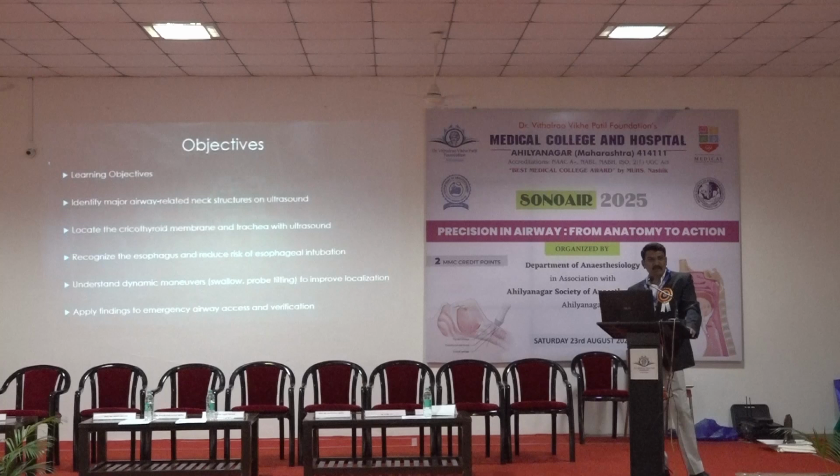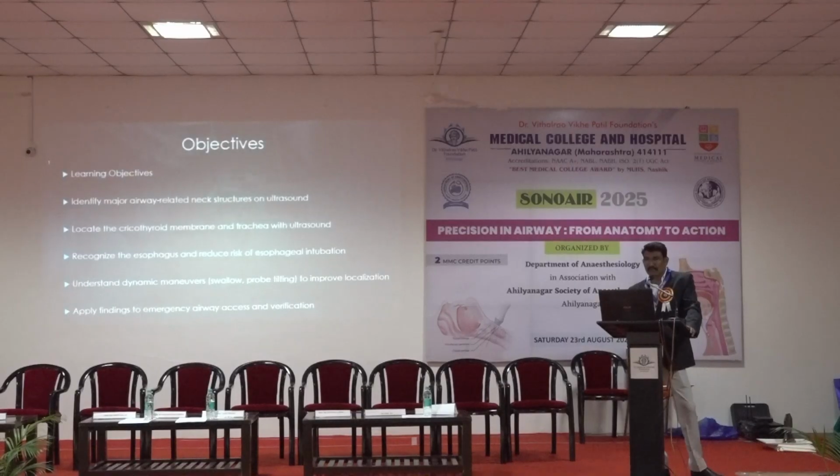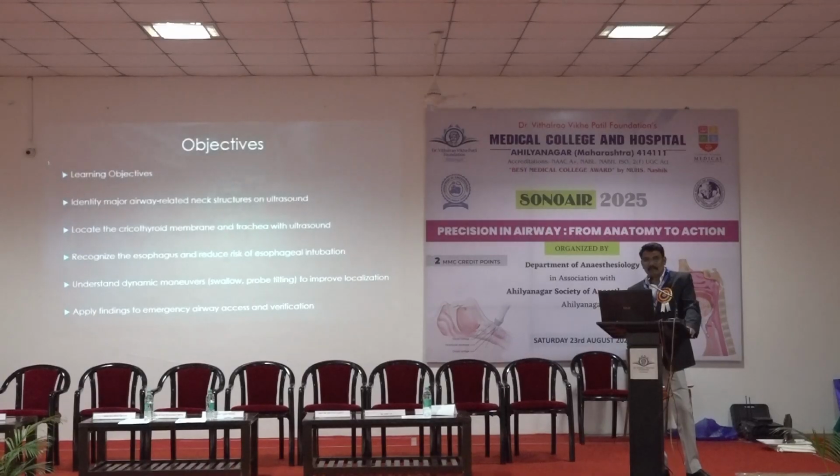Rather than going deep into the history of sonography, everybody nowadays knows it has a screen and 2 to 3 probes, called transducers. With the transducer, keeping the medium between the skin and the probe, we can go to the deeper structures, identify how they look, and find out the pathology behind them.